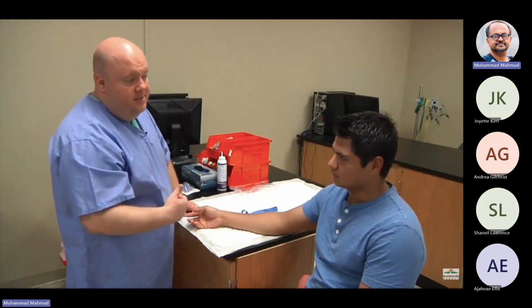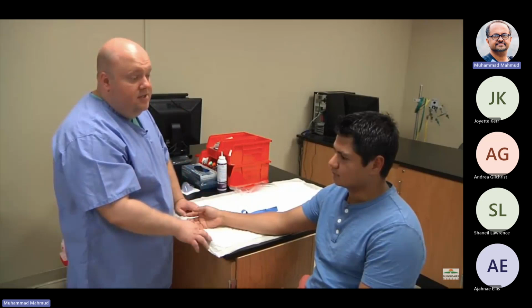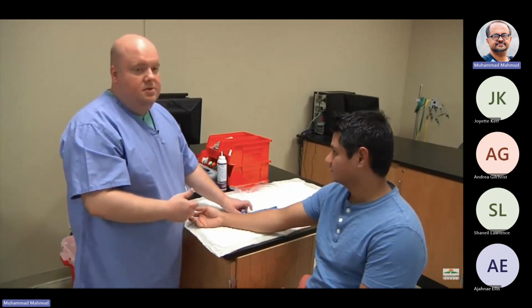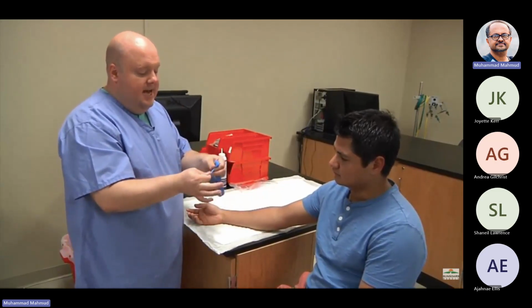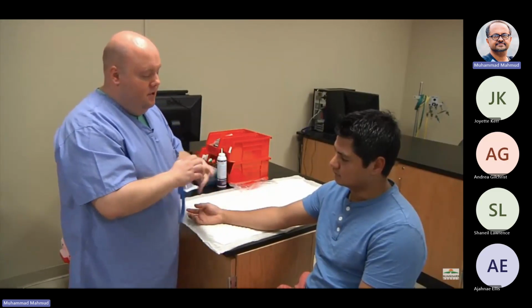Hi, I'm Trevor. I'm from the lab today. The doctor's ordered some samples from you. Do you mind if I go ahead and take a look and see if we can get these samples? Patient gives consent. So let's go ahead and begin our procedure. We have our non-latex tourniquet. Make sure it's intact, with no rips or tears or signs of soil on it.